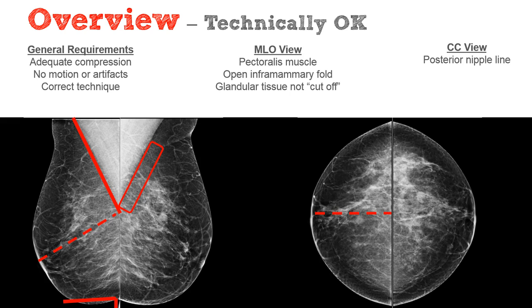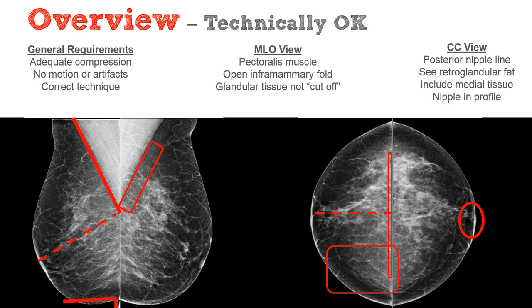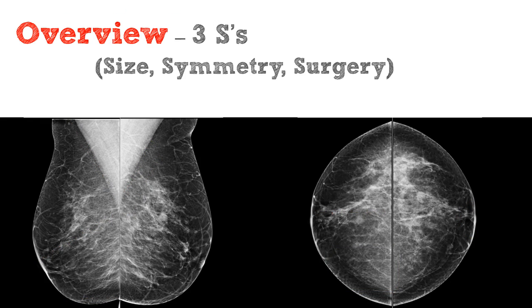Switching our attention to the craniocaudal view, the posterior nipple line is a line drawn from the nipple to the back of the image on the craniocaudal view. This should be within 1 centimeter of the distance from the nipple to the bottom of the pectoralis muscle on the MLO view. Next, you want to ensure you see a little bit of retroglandular fat at the posterior aspect of the craniocaudal view. You want to ensure that you include adequate coverage of the medial tissue. And finally, you want to ensure that the nipple is in profile.